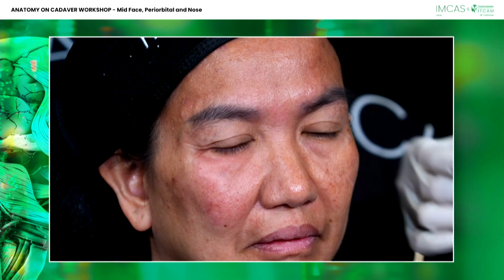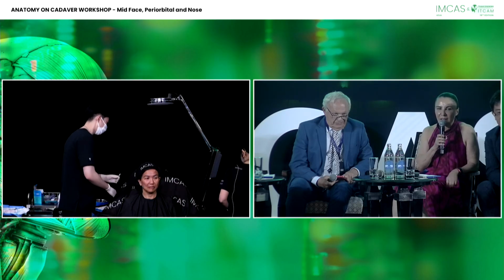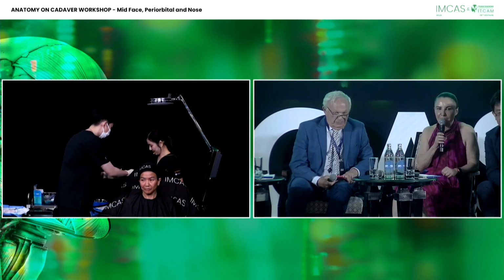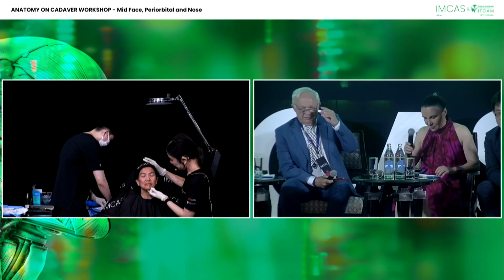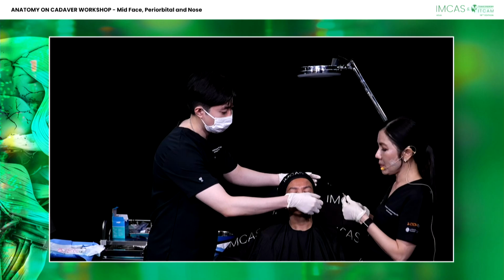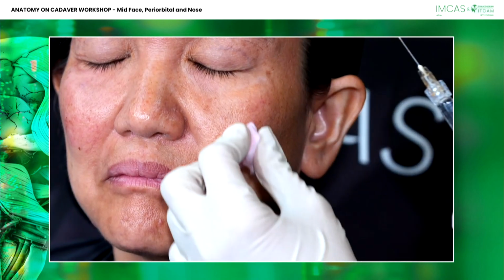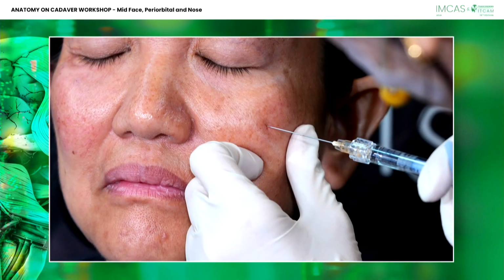Can you start, please? Can you hear me? Please start injecting the other side because the audience wants to see your injection technique, please. Oh yeah, okay, I start now. We start first with medium G-pram. Use 25 G.